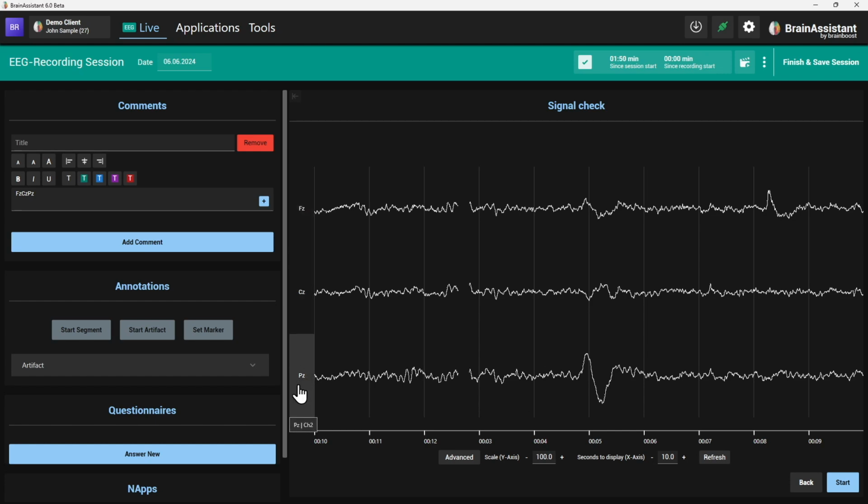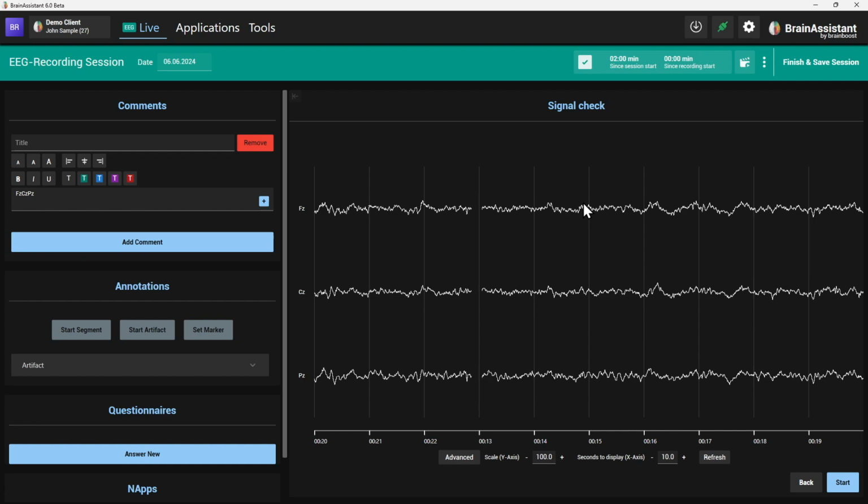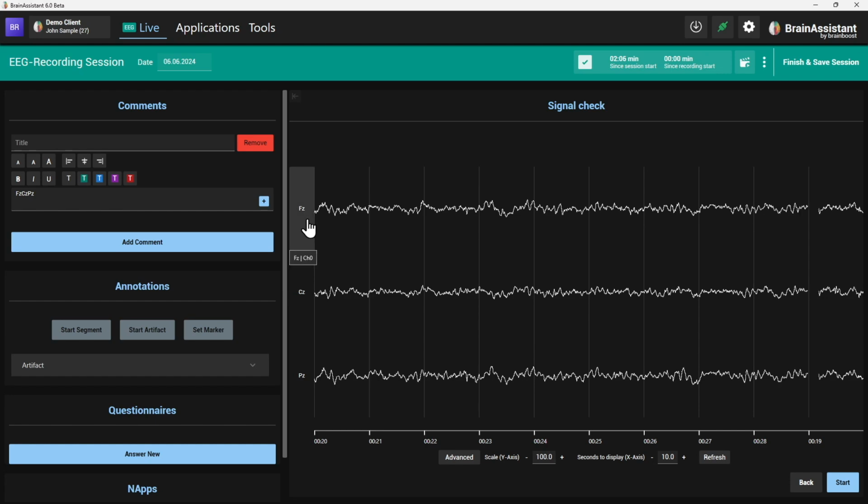If you're not sure if you did it in the right order, just place every electrode and then move to the patient, the client, and just goof around with one electrode, and you would see where you have a bad signal, where you have an artifact, so you can make sure the correct channel is in the correct position. So now we think in channels that transfer into positions.